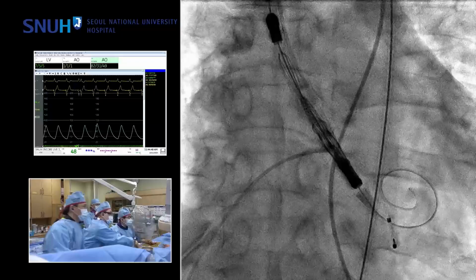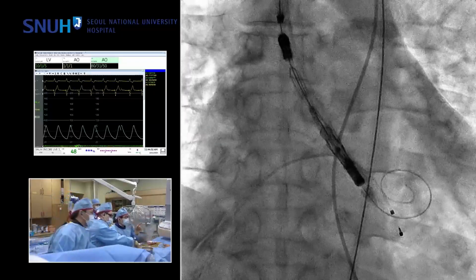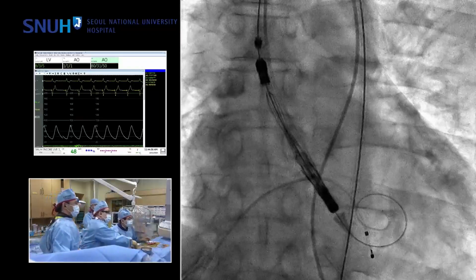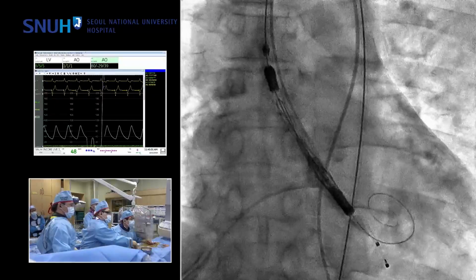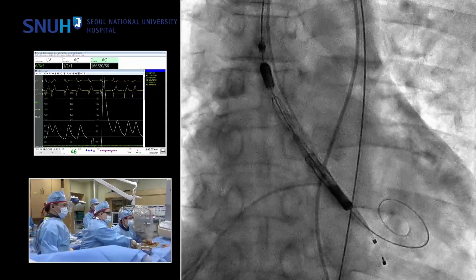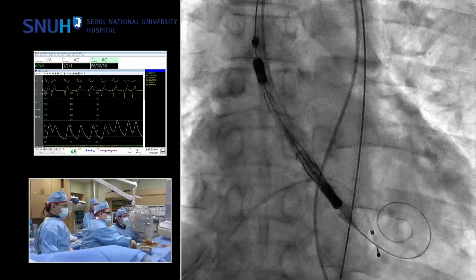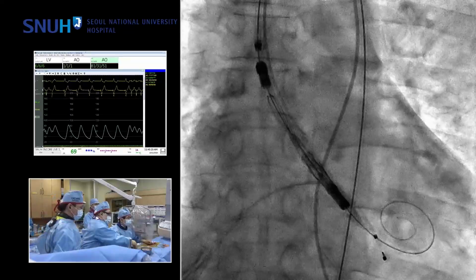The reason why I hurry up is that always when we put the device in the annulus, the blood pressure declines. But now it is okay. Let's test it. Level is good, and commissural alignment is good. Thus, I try to release the first phase up crown, slowly.